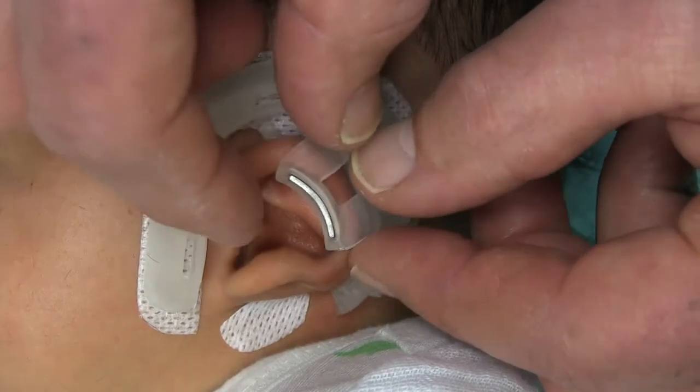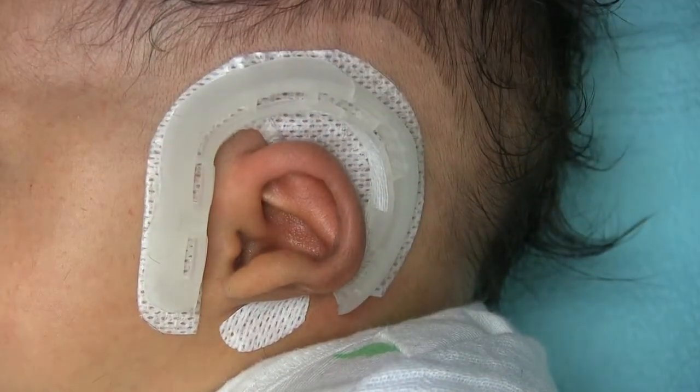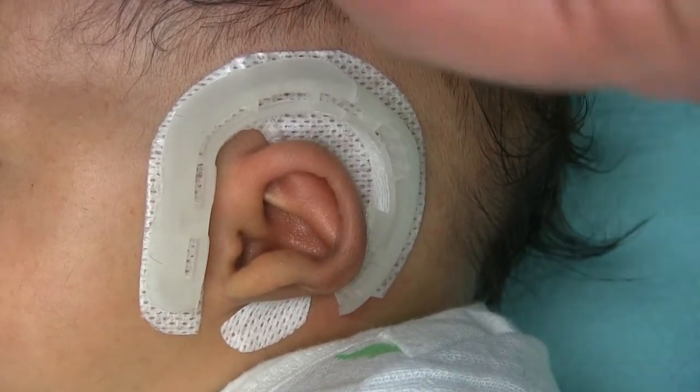Is this a large or a medium? It should be a large. Let me try a medium. This stings a little bit too far back. Okay. Let's see if I can make it work. I don't know.